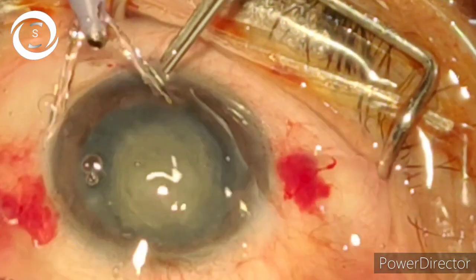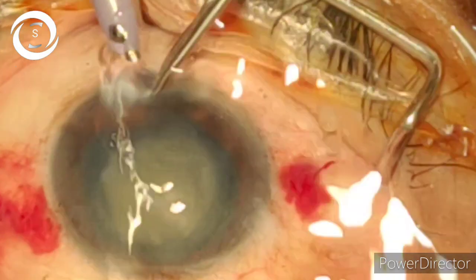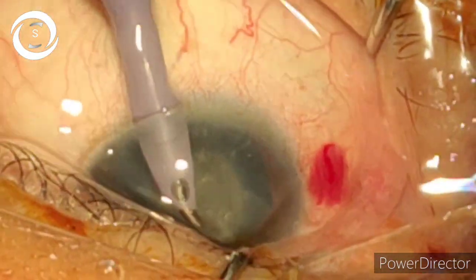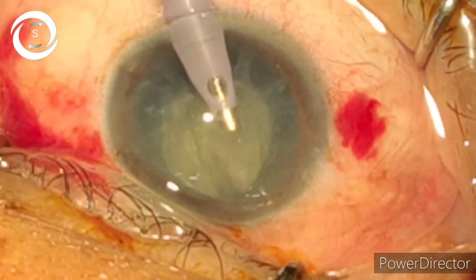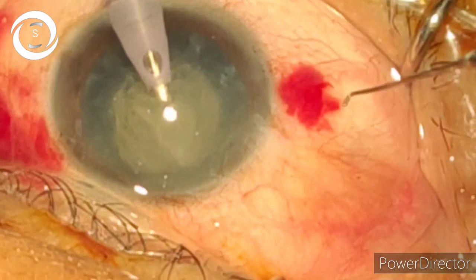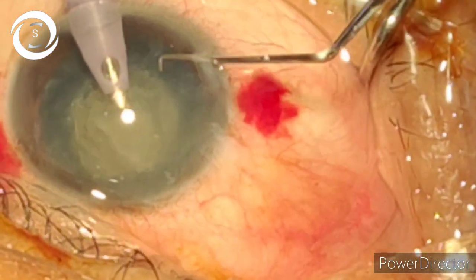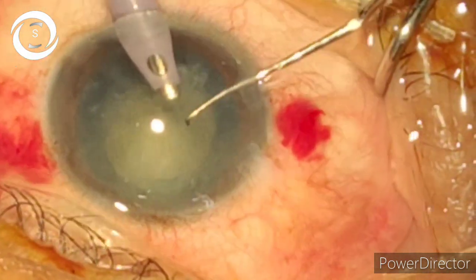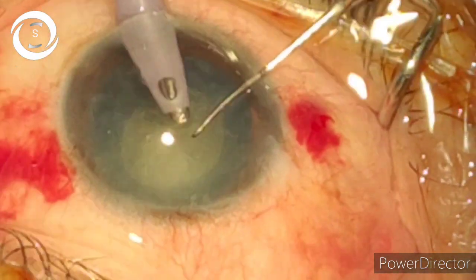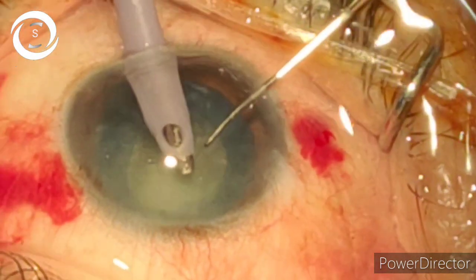Now very gently enter the anterior chamber with the phaco probe in order to avoid Descemet's detachments. After that, first aspirate all the cortical matter and air bubbles in the anterior chamber. Put in the second instrument. Now we have aspirated all that.